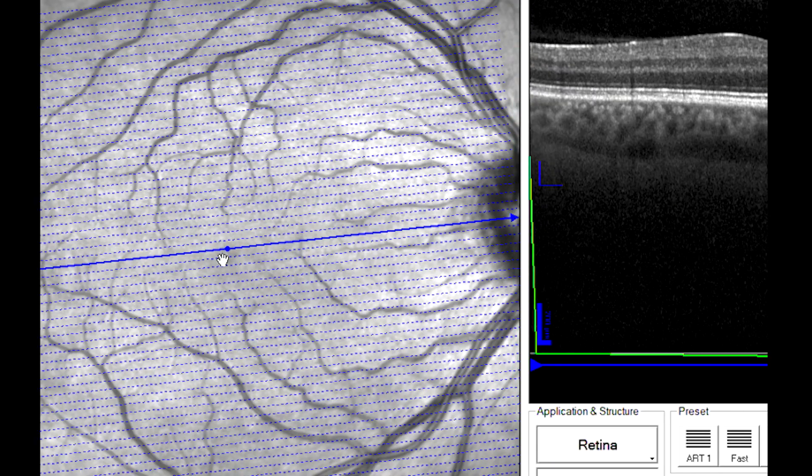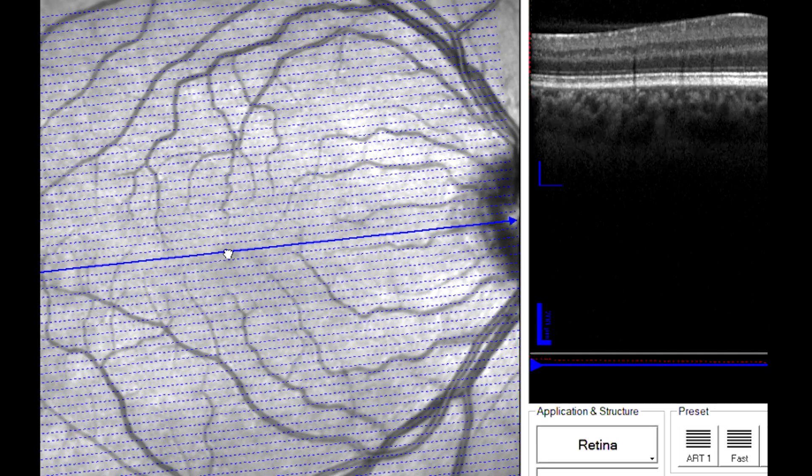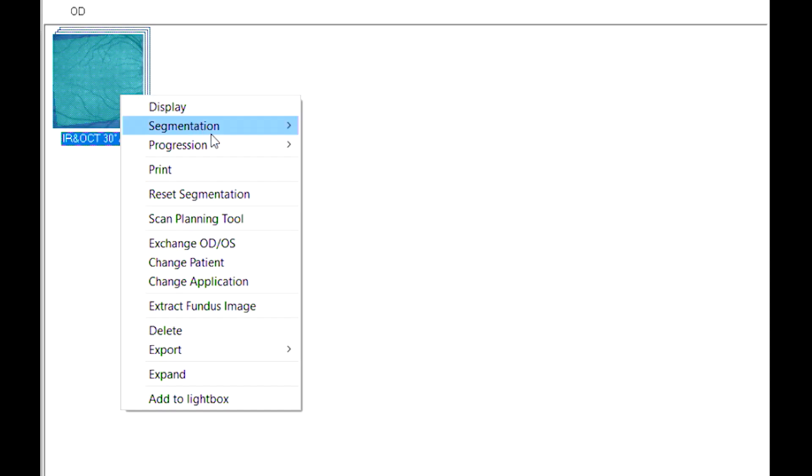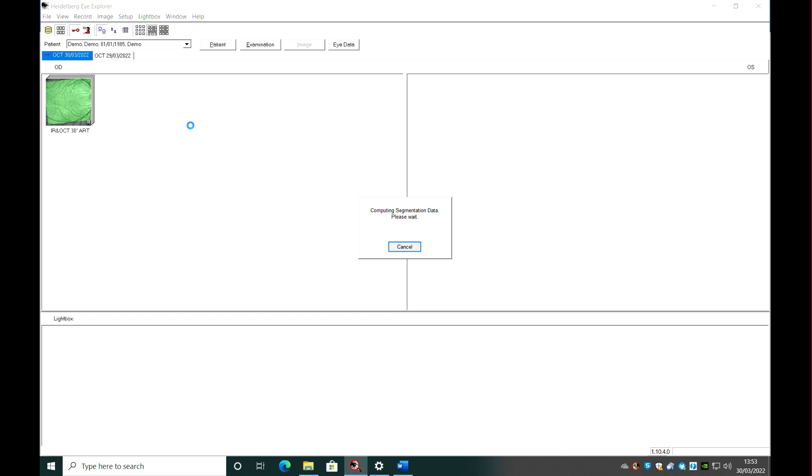Before individual layer analysis can be performed, the image must be fully segmented. All images in the time series must be segmented in order to perform comparative layer analysis. It is best practice to do this immediately following capture but can be done at any time.